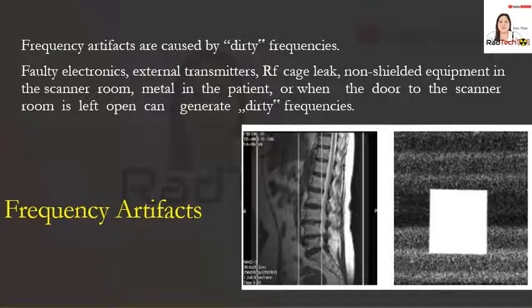Next is the frequency artifacts. So these are caused by dirty frequencies. So faulty, so dirty frequencies, parang mga sagabal siya, parang noise.